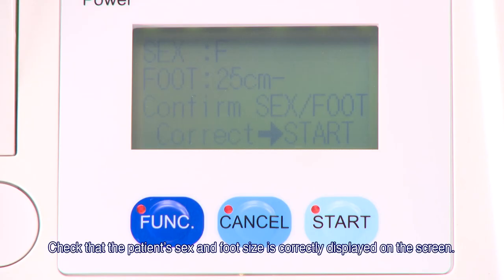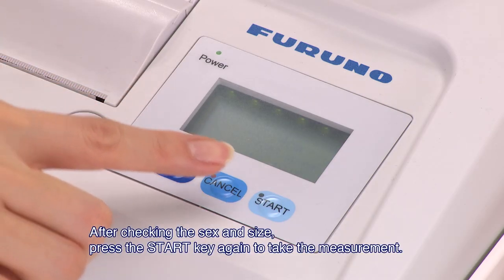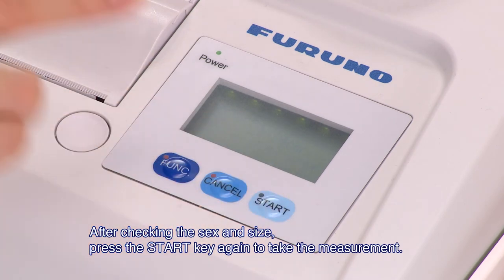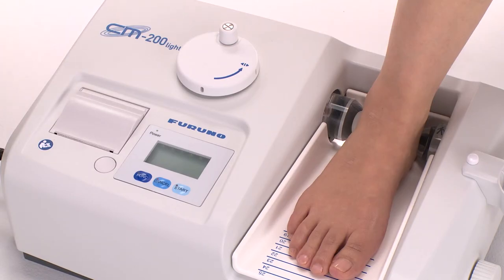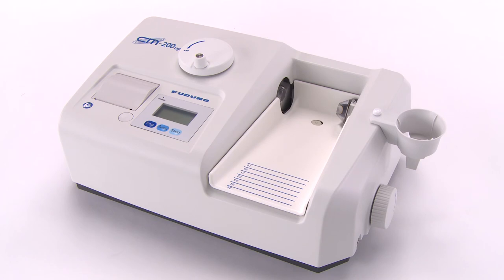Check that the patient's sex and foot size is correctly displayed on the screen. After checking the sex and size, press the start key again to take the measurement. The measurement takes approximately 3 to 10 seconds to complete. After that, the results are printed on the unit's printer. This completes the measurement process.